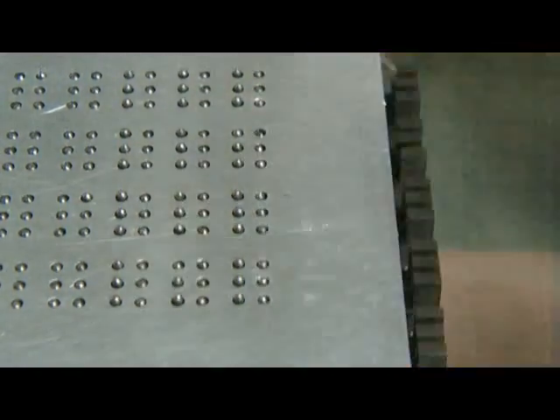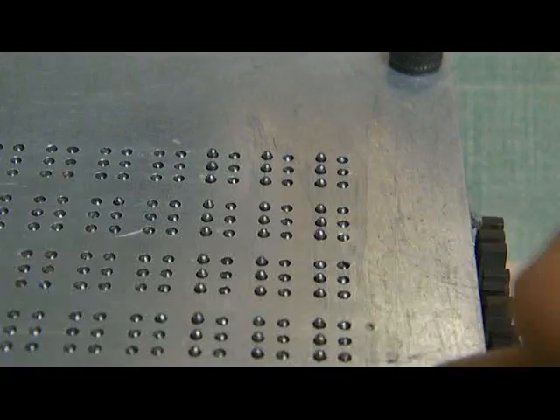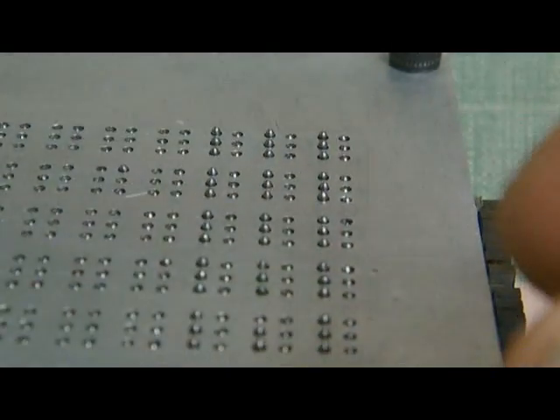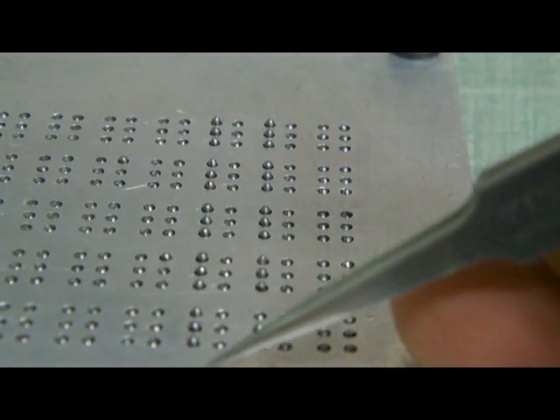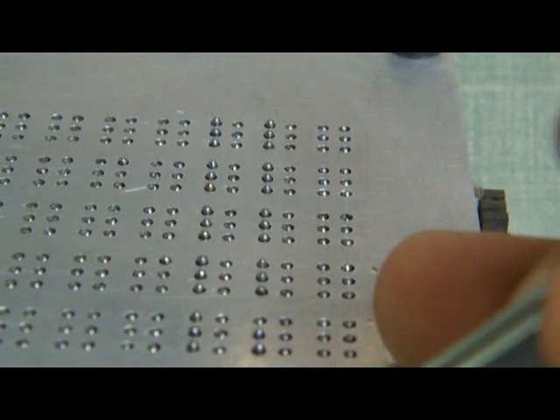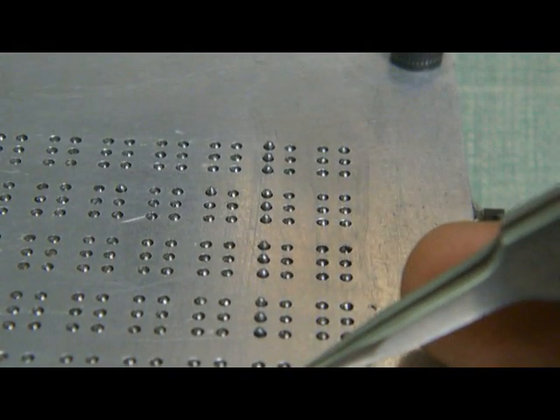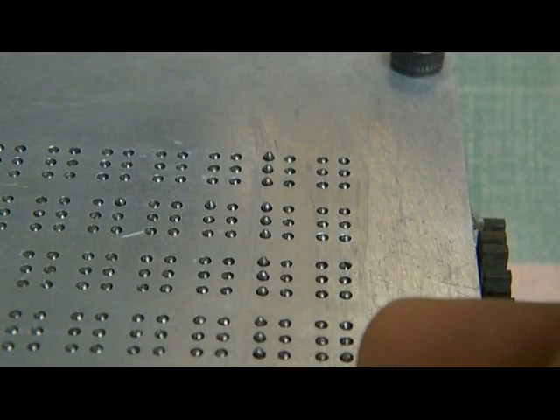Then move to the second column, like in this case, and watch what happens when I enable the column. That would basically allow the pins to drop. In this case, this is the second column, and then all the pins are latched. Did you see them? They all dropped. I'll do it for this column here. This column of pins, I can drop the whole lot just by toggling the column. See this set of pins, I can drop them by just enabling the column, and it'll drop.